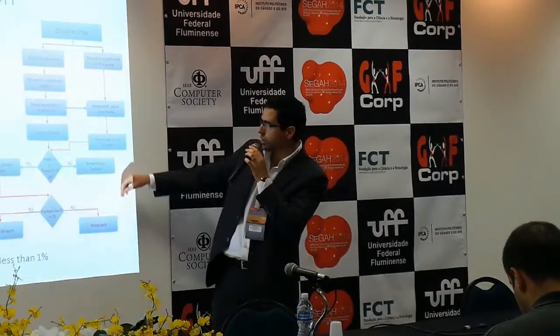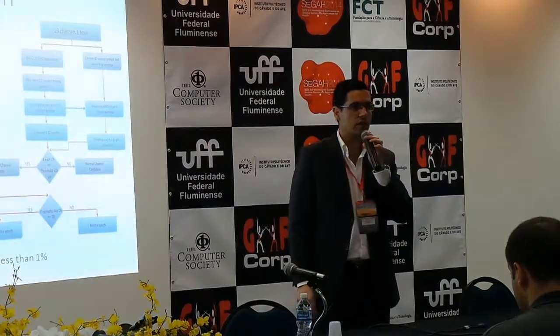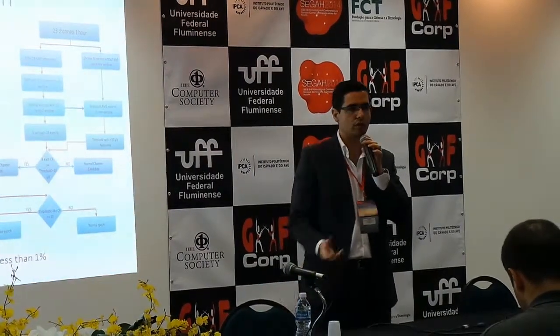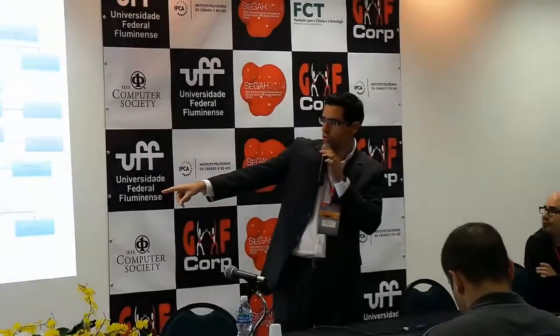signal processing part, this is not really the topic of this presentation, but it is based on an algorithm that uses the root mean square value of the signal to differentiate between normal data and epileptic data. The accuracy that we are getting is about 95% of detection rate, and the false positives are around 1%.